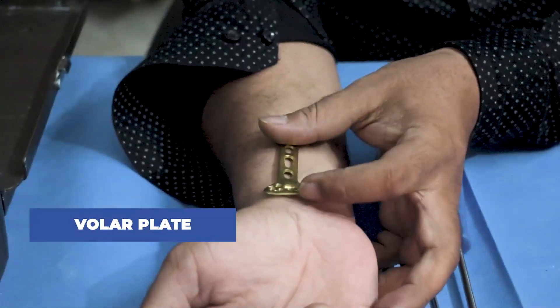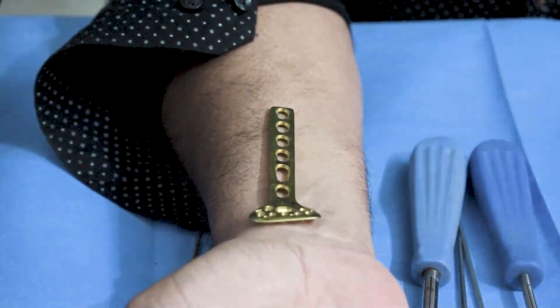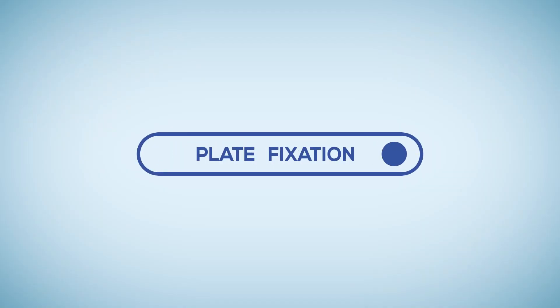Before fixation, a K-wire is passed through the K-wire hole to hold the plate still with the bone and then checked under C-arm. After that, the fixation procedure takes place.